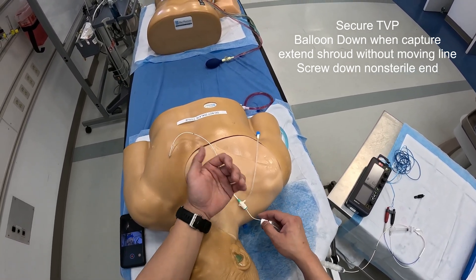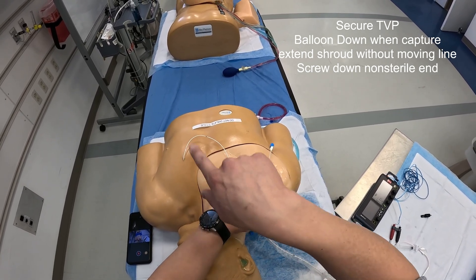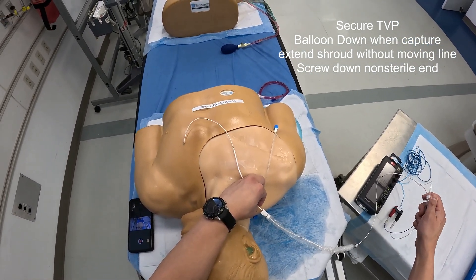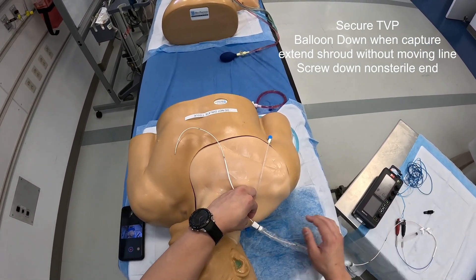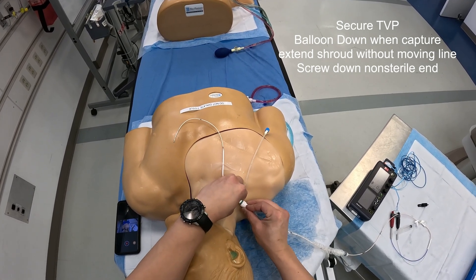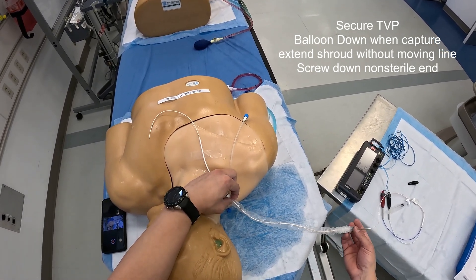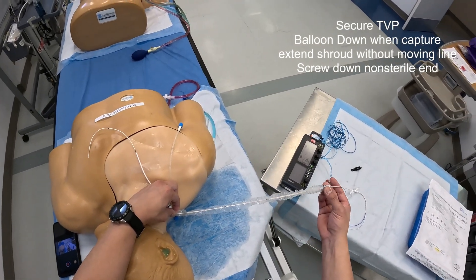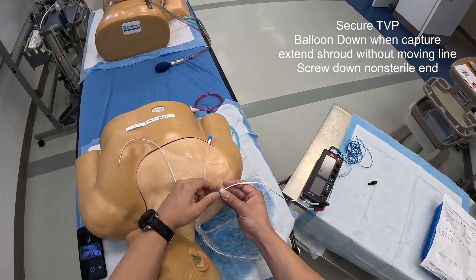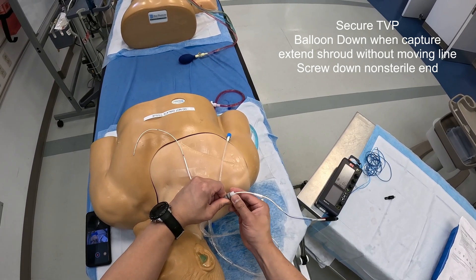At this point, make sure that you have capture. Thread just enough until you have that wide QRS morphology on your EKG, at which point take off the balloon because you don't want it to throw any clots. Go ahead and secure the shroud to the cordis so that it maintains a sterile environment on the inside. Hold on to the cord as you extend the sterile shroud all the way out, then screw it down to secure it to the line.